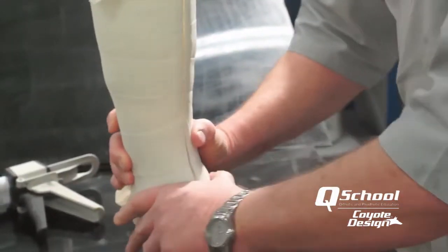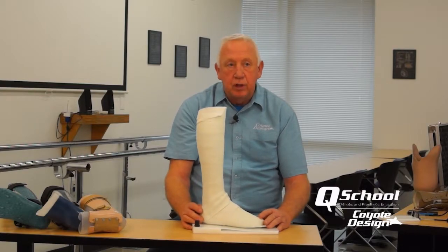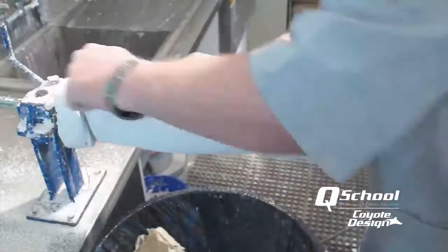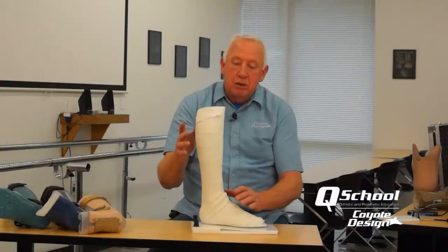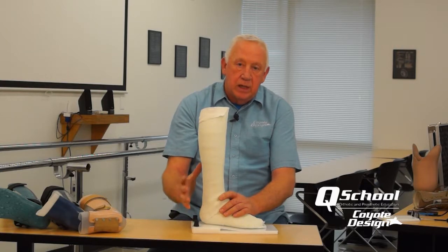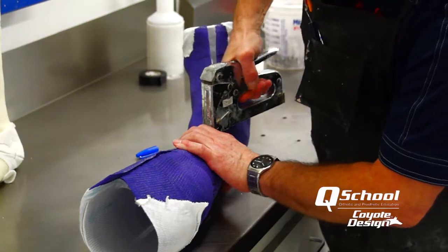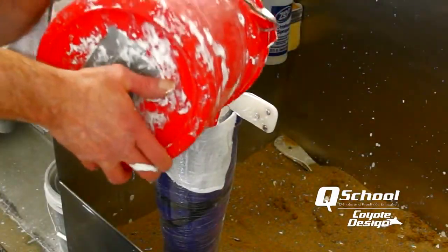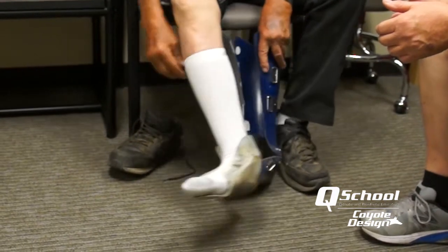We've really worked hard on getting an accurate casting method because in our patient care facility practitioners don't fabricate and don't modify the molds. They take a really good evaluation, do an accurate casting in fiberglass, and then our technicians proceed from there — doing the fill and modify of the plaster model to come up with a really well-fitting device.